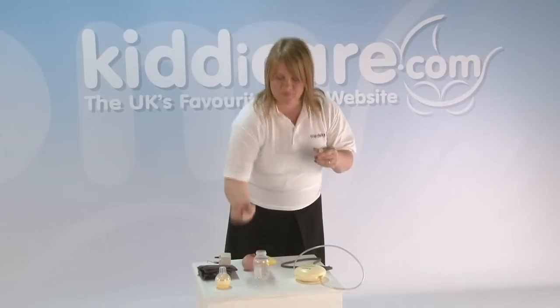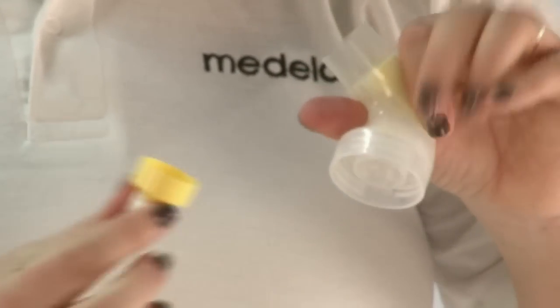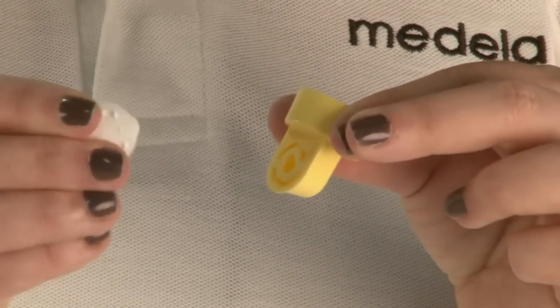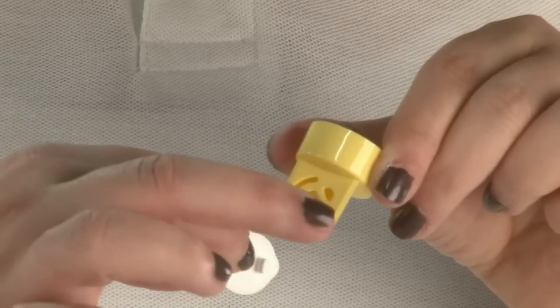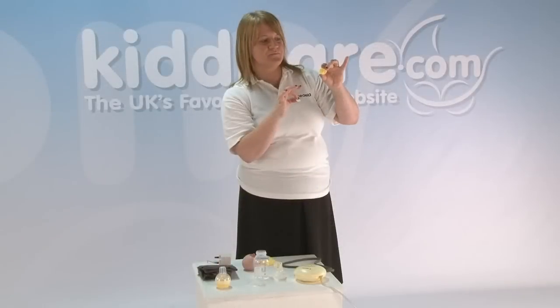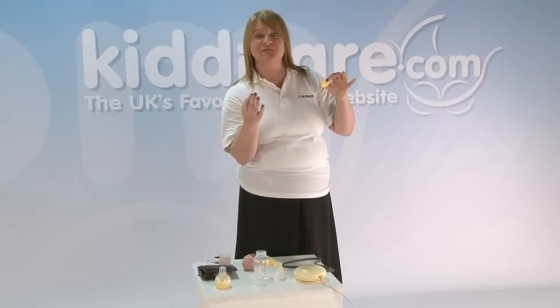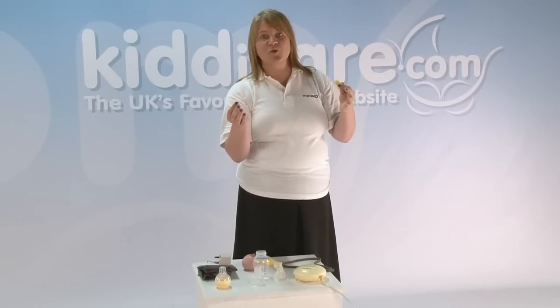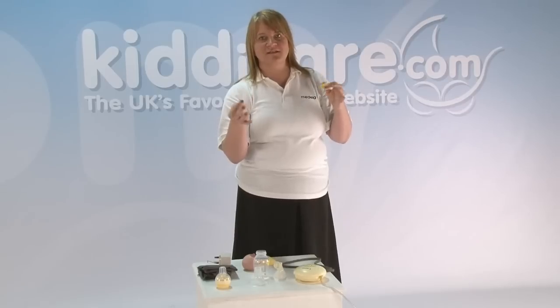Everything else is either screwed off or pulled apart. Remove the bottle, the breast shield, and then you'll notice there's a yellow valve with a white membrane — that just pulls off the main part of the breast pump. On the yellow valve you have a white membrane that needs to be pulled off, because we need to make sure we're cleaning all the little holes in the yellow valve effectively. Breast milk's quite fatty, so we just need to make sure all the fat and any residue is removed with thorough cleaning in hot soapy water. You can sterilise in your usual manner at home, whether that be steam electric or steam microwave — it's your choice.